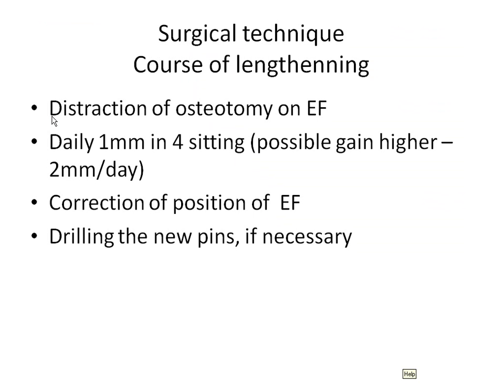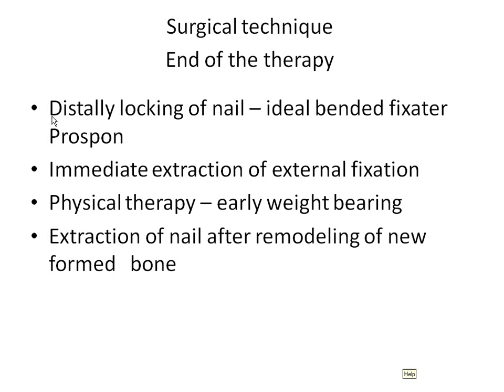Distraction of the osteotomy we make daily, 1 millimeter per day, so a quarter of a millimeter every 6 hours. We tried to make it a little bit quicker, and it doesn't seem that it does any harm to the development of the bone, but the patient doesn't like it very much. We can, of course, correct the position of the external fixation. That means we add a new pin if necessary. When we finished the desired lengthening, we distally locked the nail.